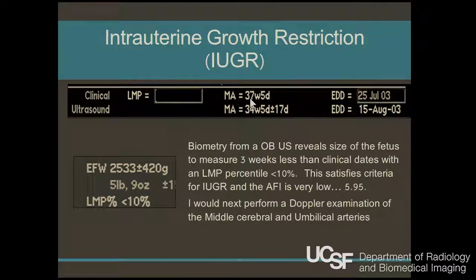And you want to compare it to the clinical dates. So in this case, it's 3 weeks less, and that's what you would report. It's 3 weeks less than dates. If it's 1 week less than dates, then you report it's 1 week less than dates.